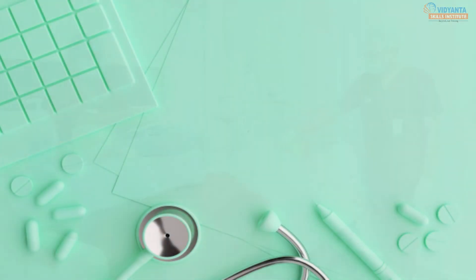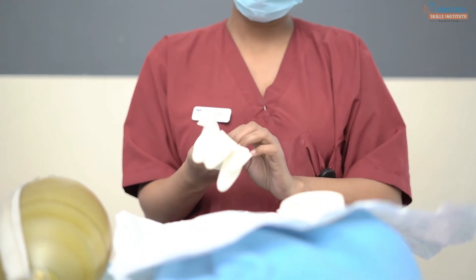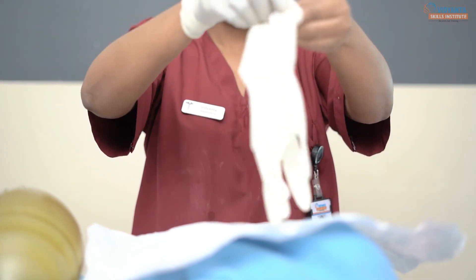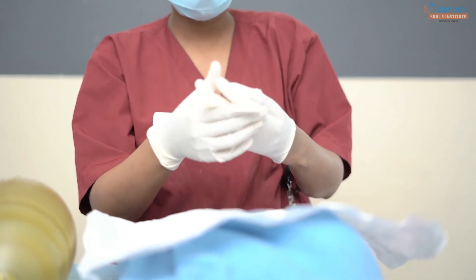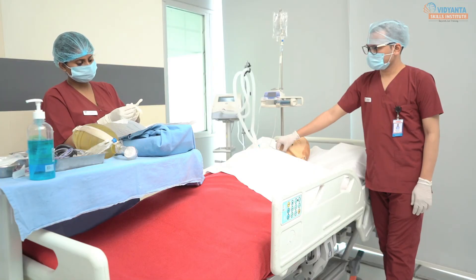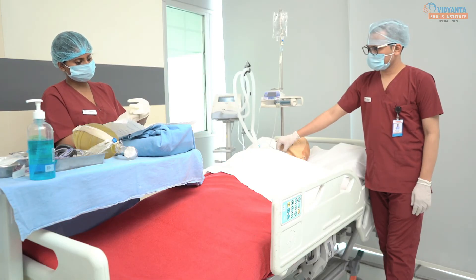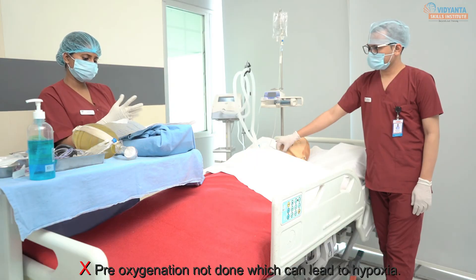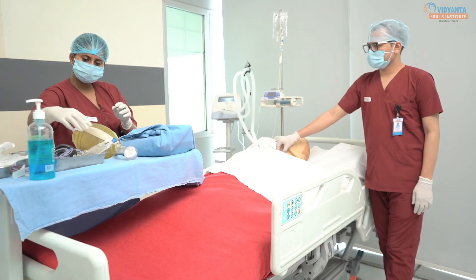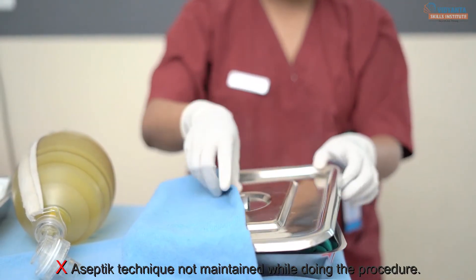Common errors: 1. Improper donning of sterile gloves leading to risk of infection. 2. Pre-oxygenation not done, which can lead to hypoxia. 3. Aseptic technique not maintained while performing the procedure.